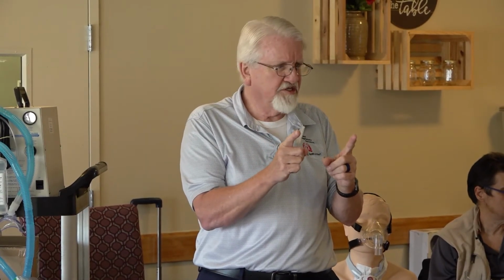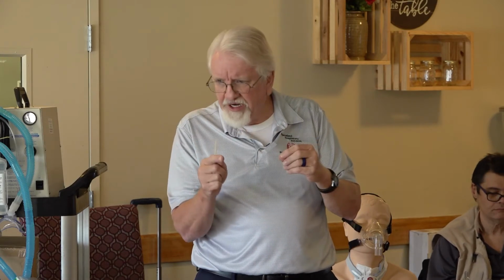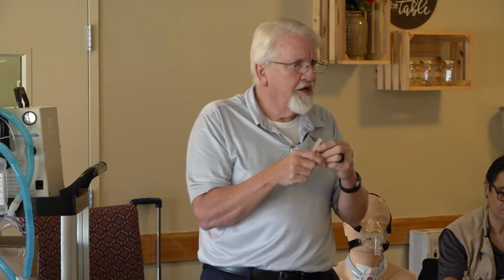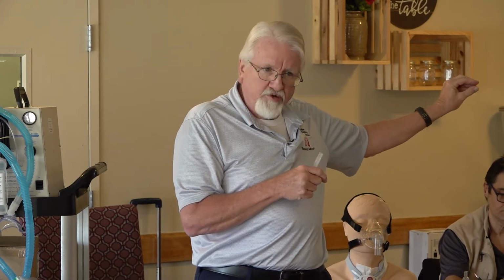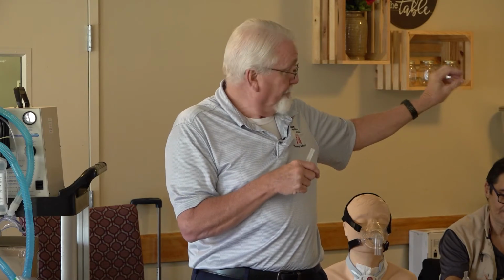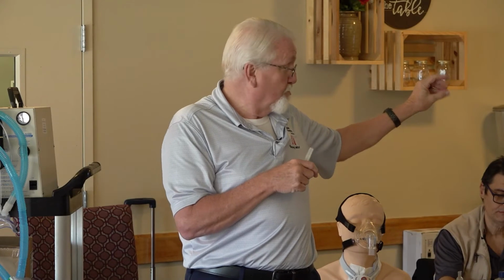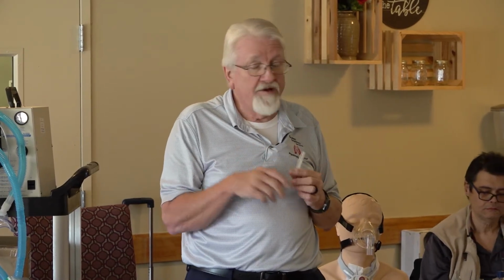It's about 5-6 inches long. Plunger at one end, and then at the other end looks like a miniature Christmas tree with a hole in it. And what that is designed for is so you can put the Christmas tree at the end of the TEP and plunge some water. You're going to put some sterile water in there and you'll plunge it through. So those are the 2 things you'll have.